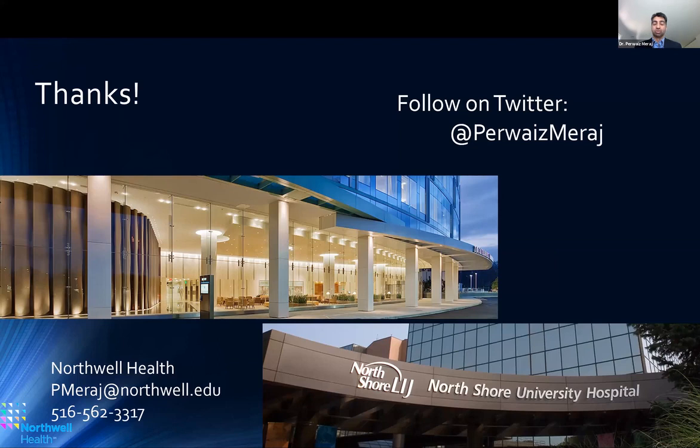because if you have suboptimal stent expansion and you place your stent and you're unable to expand it, at that point the only thing you can do is either use high pressure balloons or use IV lithotripsy. The benefit of having imaging is being able to use the appropriate atherectomy device prior to your stent deployment, so you have more options available to you.